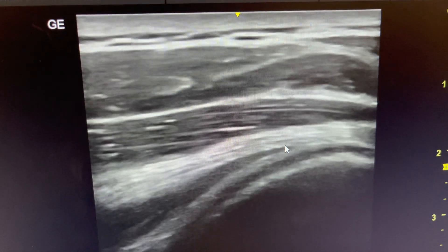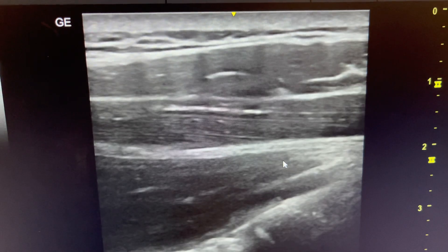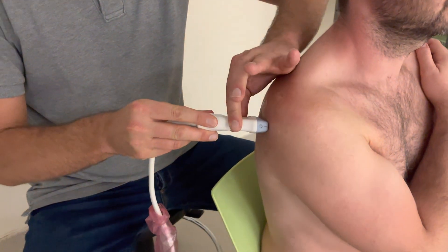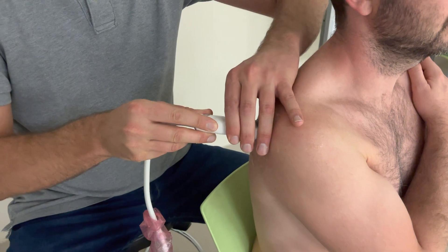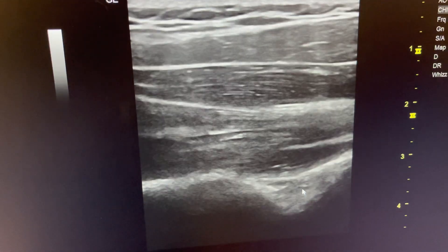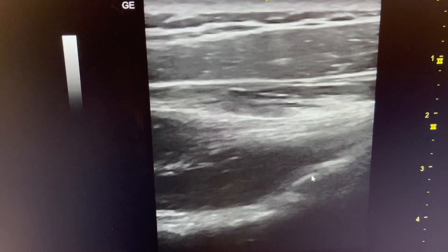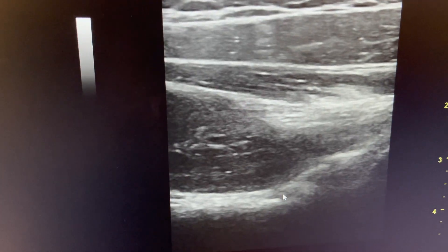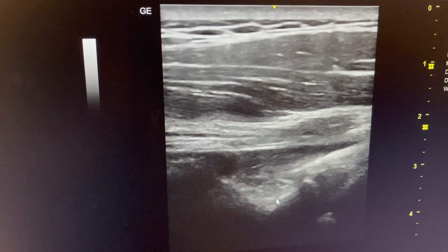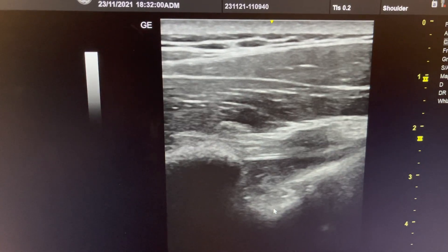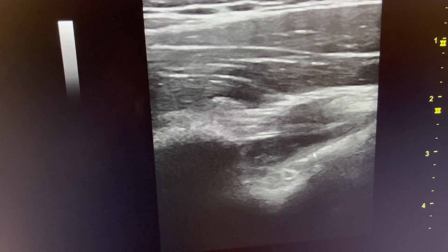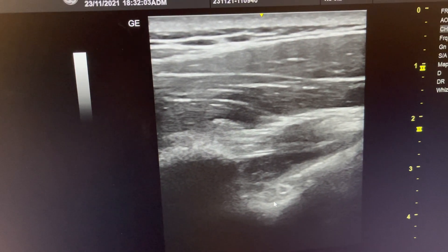So we go back again with the same maneuver — this is actually a very nice example. We go back, and now we move the probe a little bit cranially, from this position going a bit more cranial. Then you can see the bone of the scapula. I'm here in this position — there we have the glenoid again with the labrum, this is the bone of the scapula. Going a little bit more cranial — sometimes it's hard to find, but now we see it. It's a little bit vague, but it's enough to make a diagnosis. This is the bone, goes down, comes up here — so this is a notch.